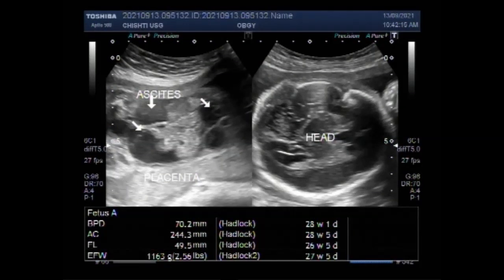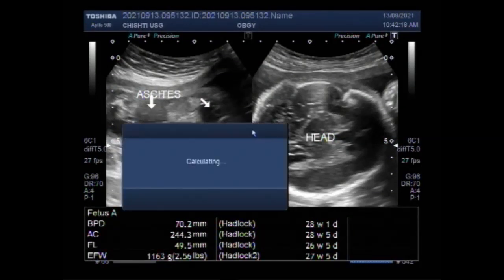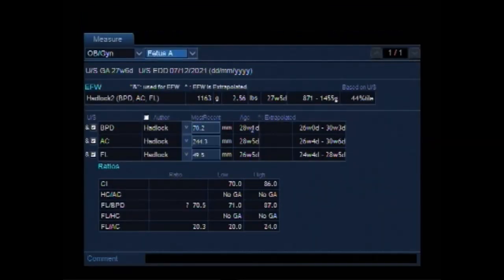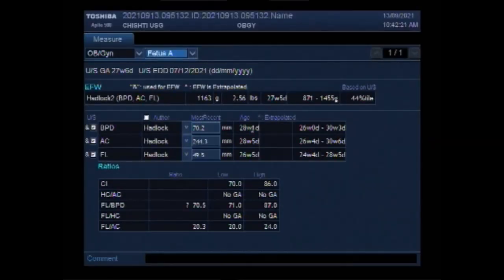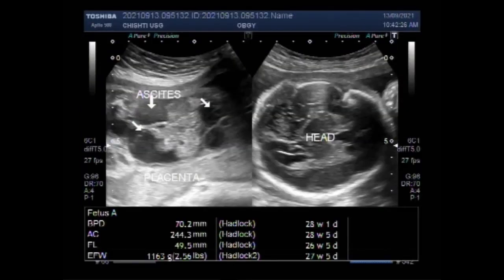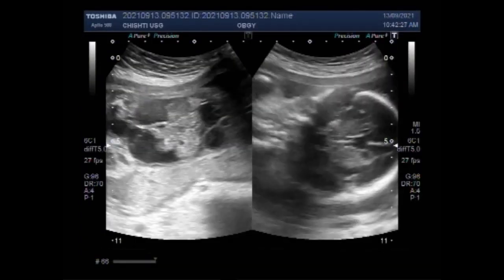This ultrasound video shows multiple fetal anomalies including fetal ascites, fetal hydronephrosis, pericardial effusion, and dilated brain ventricles.